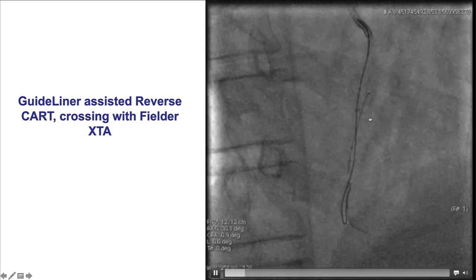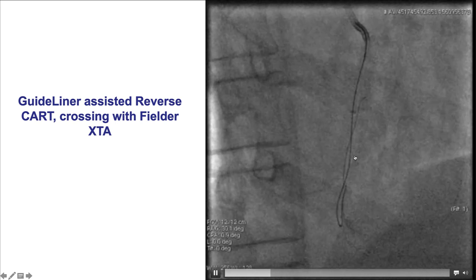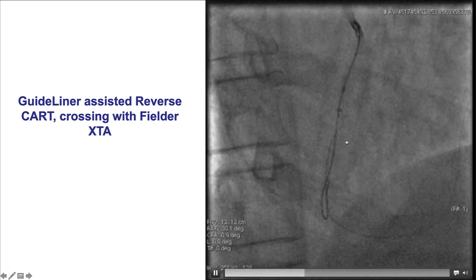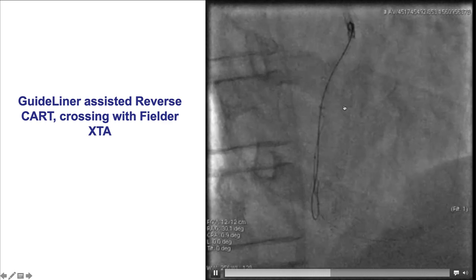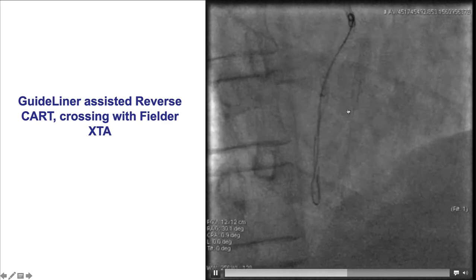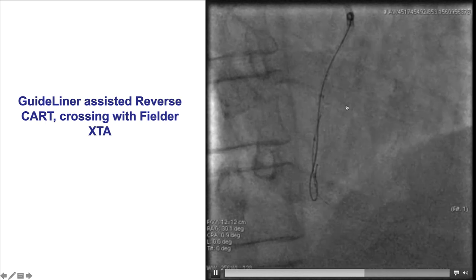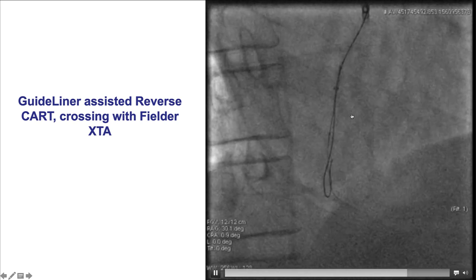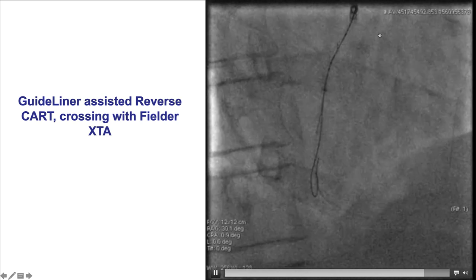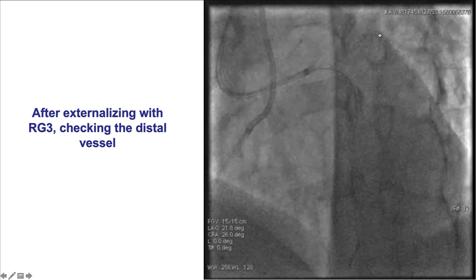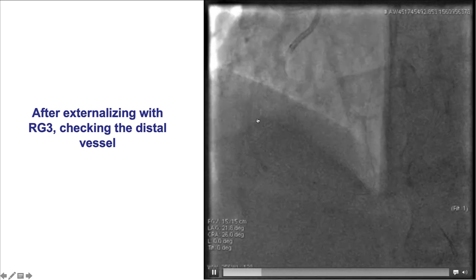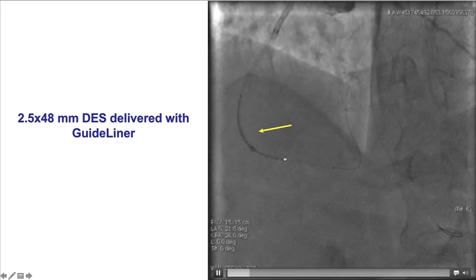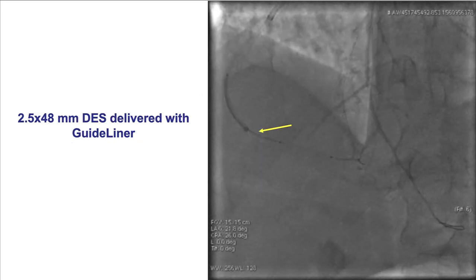A guide extension can significantly facilitate performance of the reverse CART. This is a retrograde Fielder XTA. It was pulled back and redirected and eventually found its way into the antegrade guide catheter extension, truly minimizing the length of tissue and occlusion the retrograde wire has to cross to enter the antegrade guide catheter. An RG3 guidewire was then externalized, followed by stenting of the distal right coronary artery.